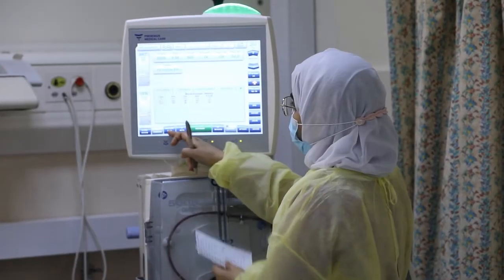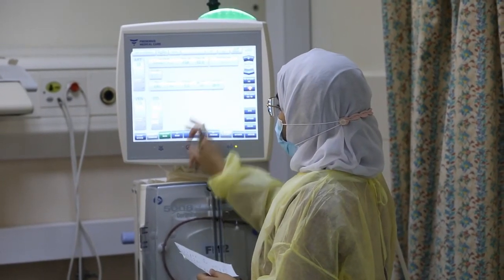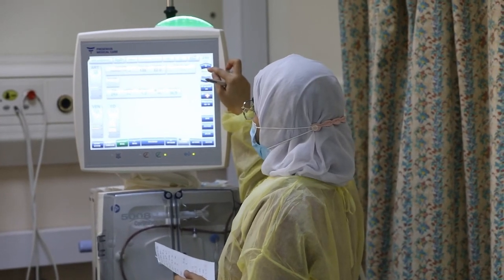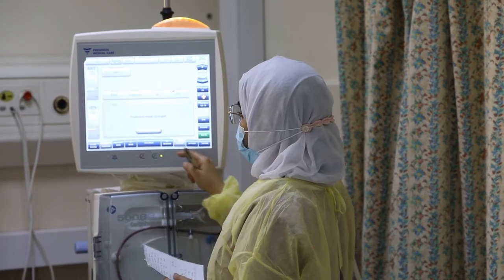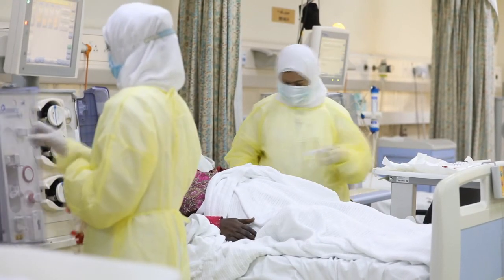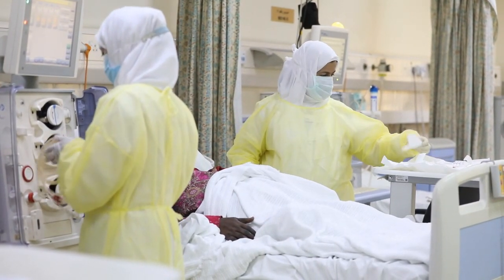It helps us know the result right after finishing the dialysis, with no need to wait for the end of the month to know the result from the doctor. And then, if the result is not okay, we can ask the doctor what to do to improve ourselves in getting more clearness. To reach the target, there are many things you have to follow, for example the speed, how much it should be, and many others. Mostly we come to know these from the sisters and brothers in the Boucher Center. They can give more information.